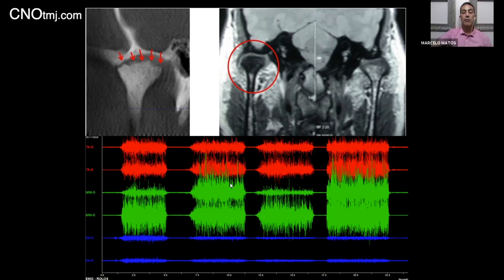Same situation as the other one, right quarter roll, left quarter roll, both sides. In this case, the left quarter roll generates an inhibition of the opposite side even bigger than the original one. It means that when the mandible is stabilized in an unstable position with the stop only at one side, in this case the left side, it is very complicated for the other side, which has no teeth, to also support the mandible on the joint and hold that situation.